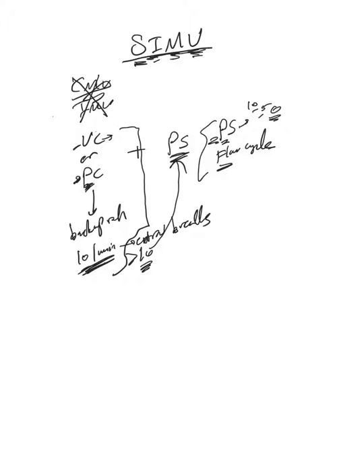So simply that's SIMV. And synchronous means that the ventilator syncs its breaths with the patient's breaths, and that's what's happening already, because of assist triggers. For a patient trigger, the ventilator will sense that and deliver that breath, and the backup rate will kick in only if it doesn't get any patient triggers. It's not that I'm going to deliver these 10 breaths in a minute regardless of whether there is a patient effort within the specific period of time that we talked about before.